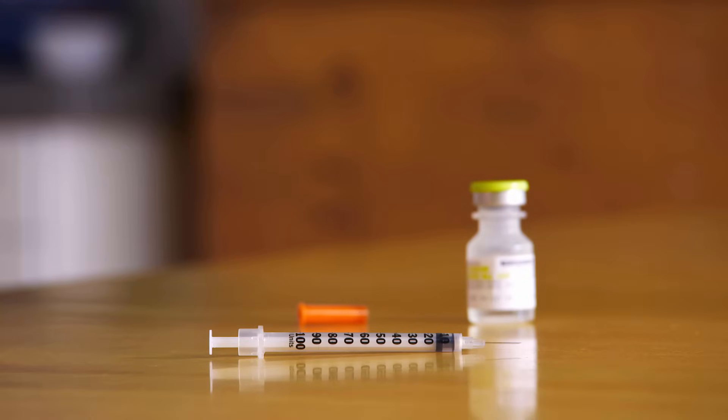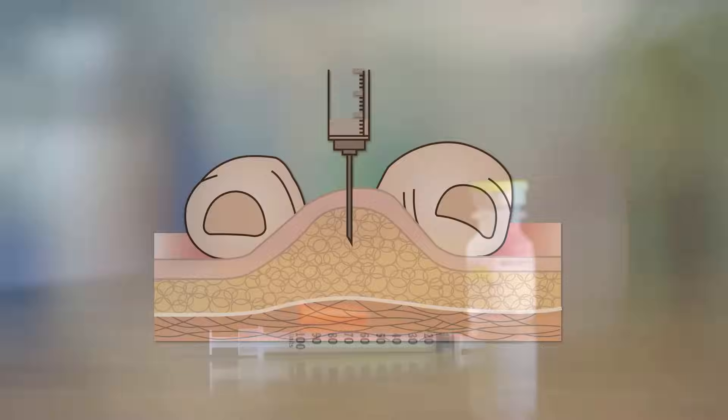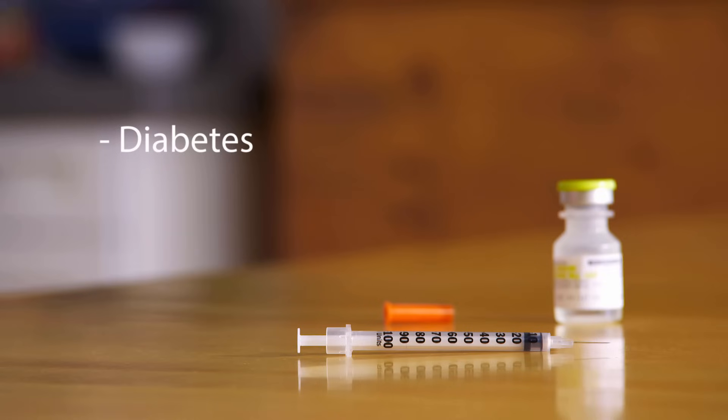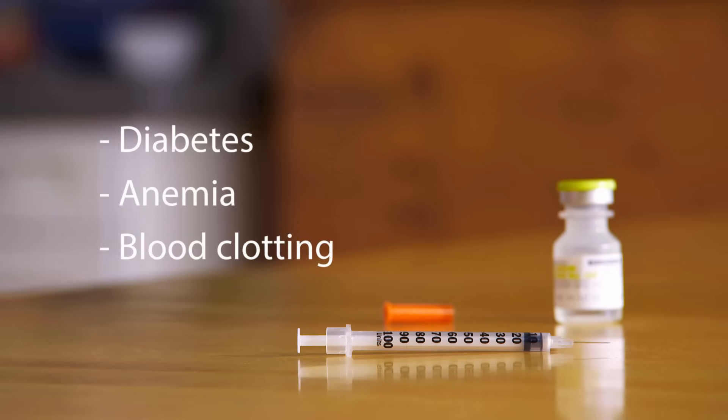This video will show you how to give a subcutaneous, or sub-Q, injection. Subcutaneous means below the skin. To give a subcutaneous injection, you stick a small needle into the fatty tissue just below the skin and inject the medicine there. Subcutaneous injections are used for all sorts of health problems, such as diabetes, anemia, and problems with blood clotting.